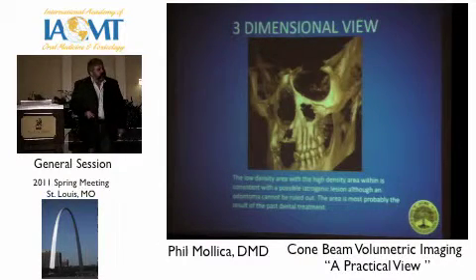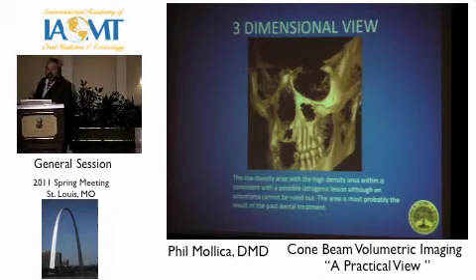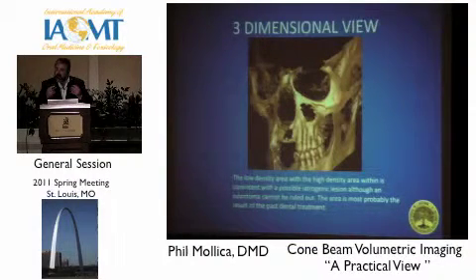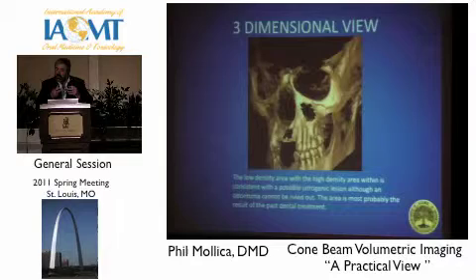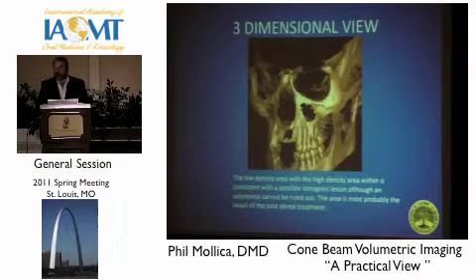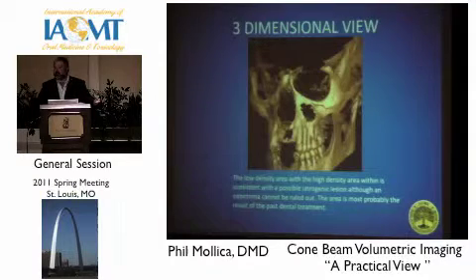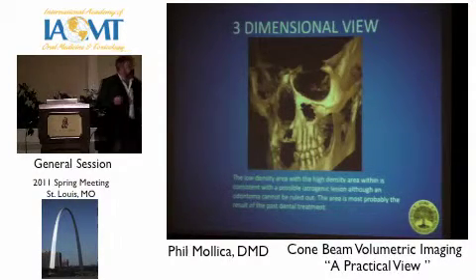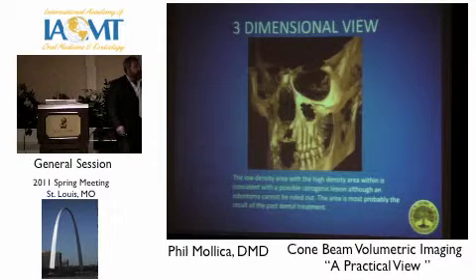So we downloaded the scan and sent him off to an oral surgeon who went up there and carefully debrided and cleaned that area. The nerve was wrapped up in a granulomatous type of tissue. Debride it. Guess what? He's fine. He cleaned up that lesion. Now he's full go. As a matter of fact, he's back on the pro tour, and I'm going to see him in a couple of weeks.